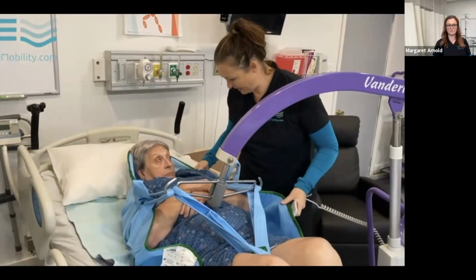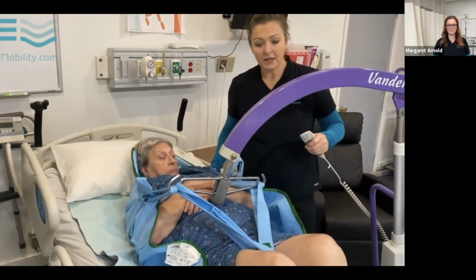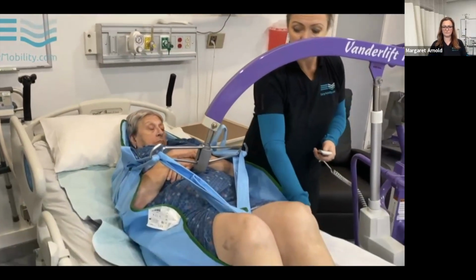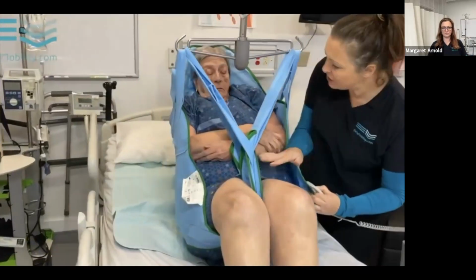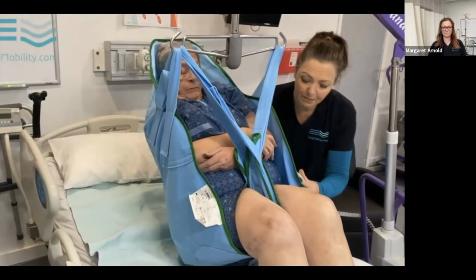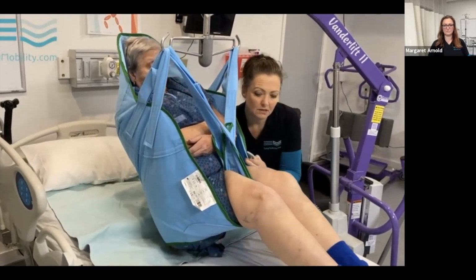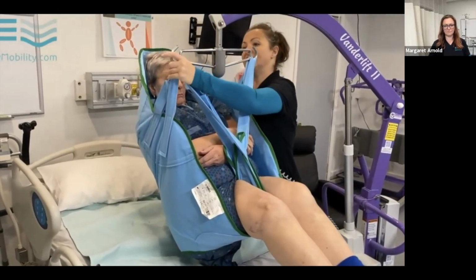Jen, we're going to go ahead and lift you up. If anything pinches you, let me know, all right? As you lift the patient, check for pinch points. Ensure the patient is fully supported. It's not pinching in your legs. No. Especially as the patient comes off the surface. Double check all of your attachments.